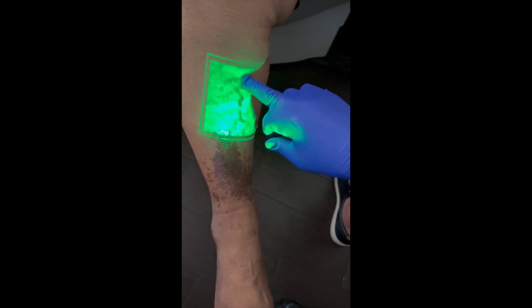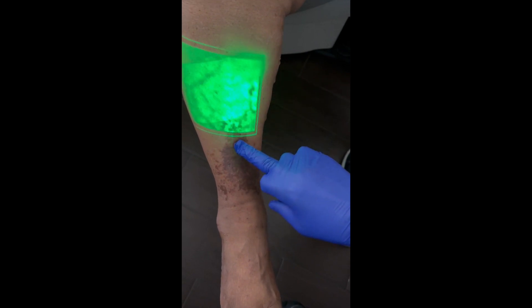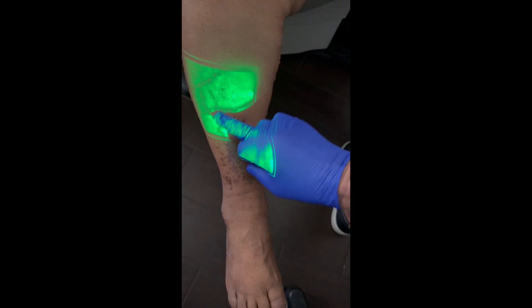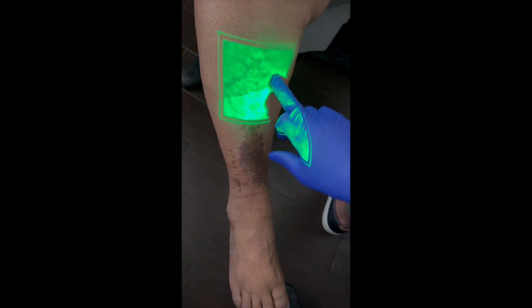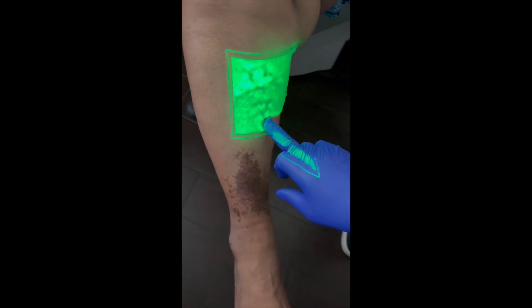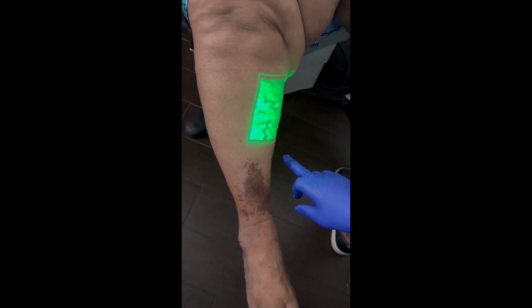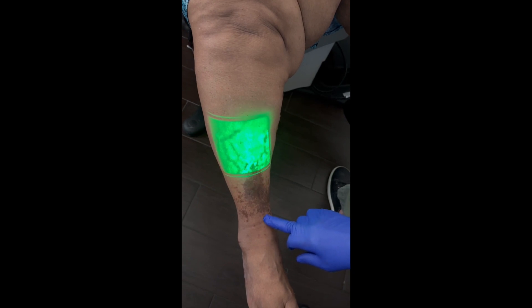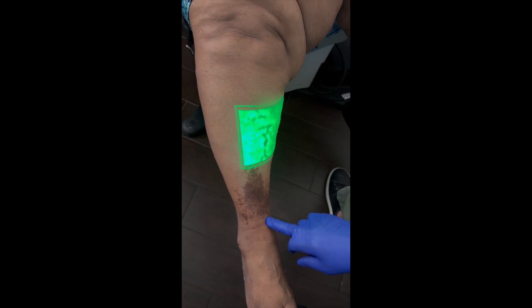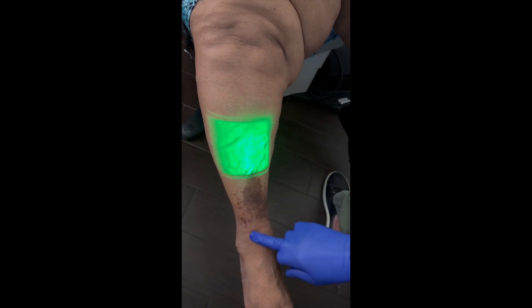This big branch right here is coming in to all this area right here. There's another little branch over here, looks like that's coming in right here. We're going to inject both of these today. They come off the GSV. The GSV doesn't leak except for that one area where this branch comes off. She has two branches to inject today, and this is probably the etiology of all the stasis you can see.